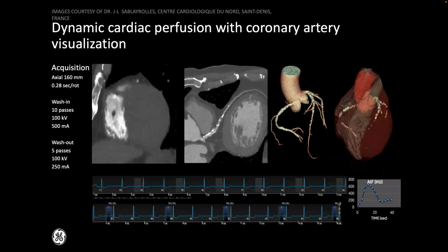We'll move on now to look at perfusion with cardiac CT. If you want to look at whether blood flow is going to the myocardium everywhere, or, given this poor state of affairs with these coronaries, you can see how much calcium is on these coronary arteries here. This is a case where trying to read this for stenosis is impossible because it's just covered in coronary calcium. So it's almost like it's inside a shield.